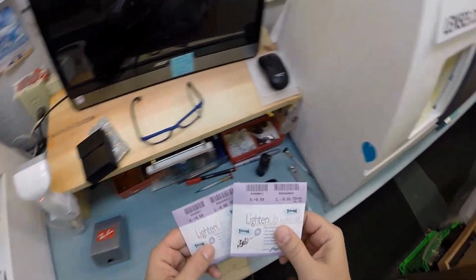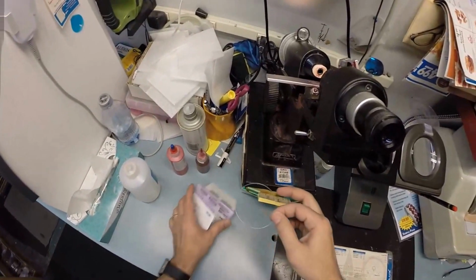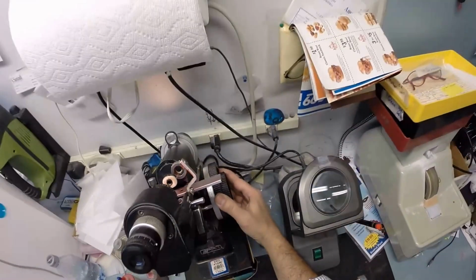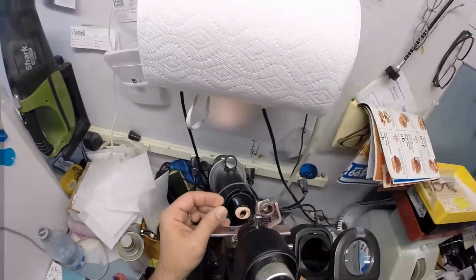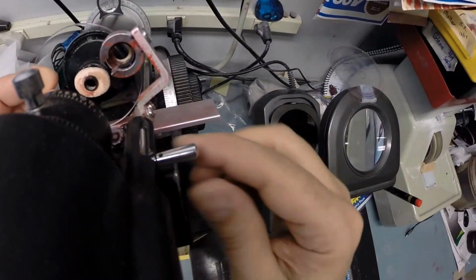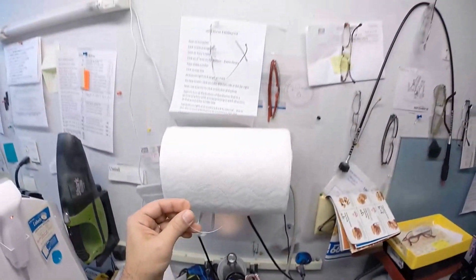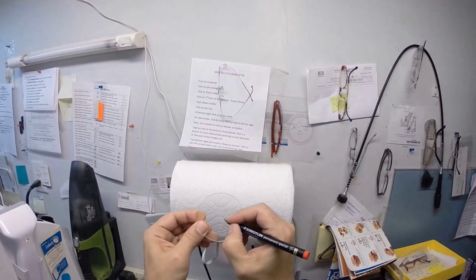So these are your lenses. I'm going to come down here to my Marco 101 lensometer, take the first lens out of the sleeve, put the power drum, let me zero it out. Okay, put the power drum on plus 50, put the lens in, find the optical center of the lens. Then I'm going to put a dot on the center of the lens, which is very light.